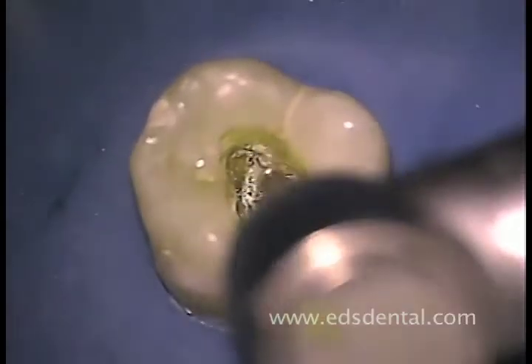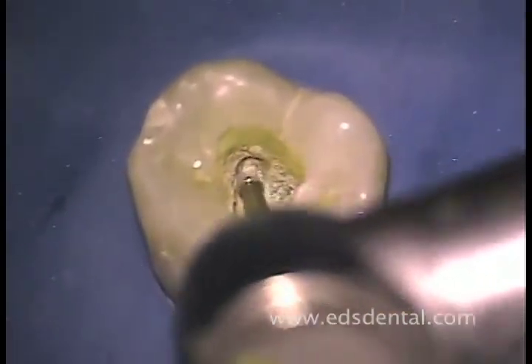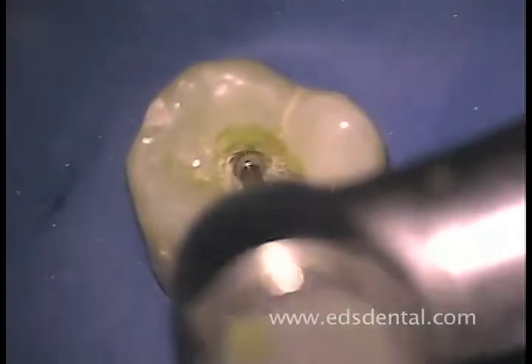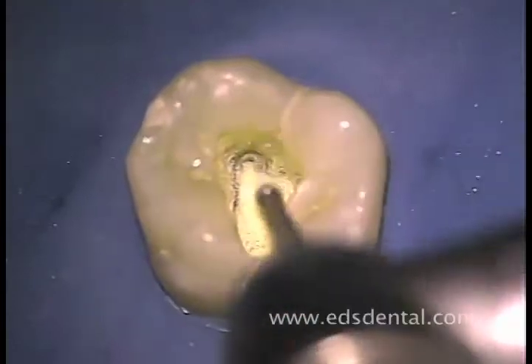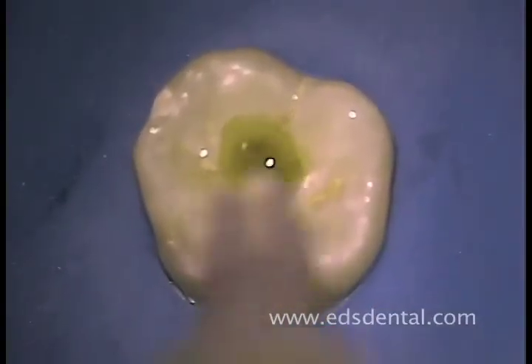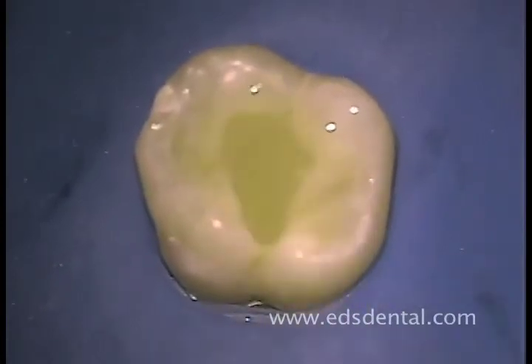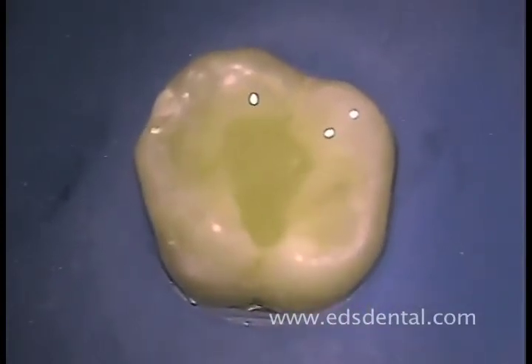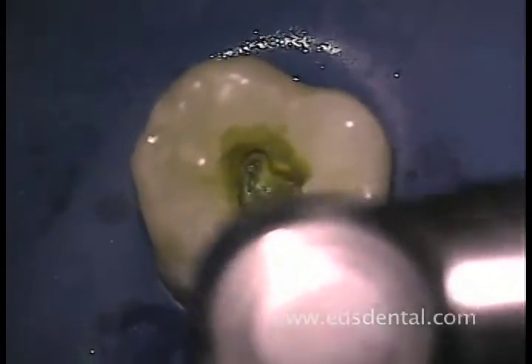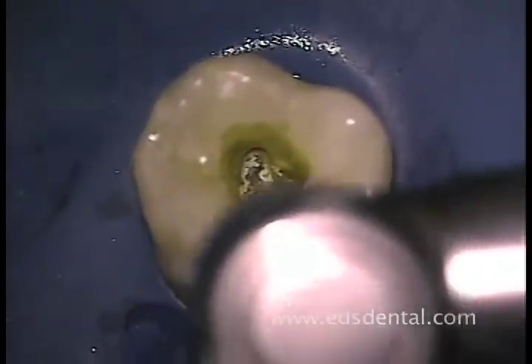Please note that it took several extensions with the round burr to be fully satisfied with the access I had to the mesial buccal canal and any other canals that might be in the immediate vicinity. Unlike the distal buccal and palatal orifices that appear to be reasonably round and simple in anatomy, the mesial buccal portion of the floor suggests more than the simple anatomy of a single round orifice. After irrigation with sodium hypochlorite, it is even more obvious that the mesial buccal portion of the floor must be examined in greater detail.